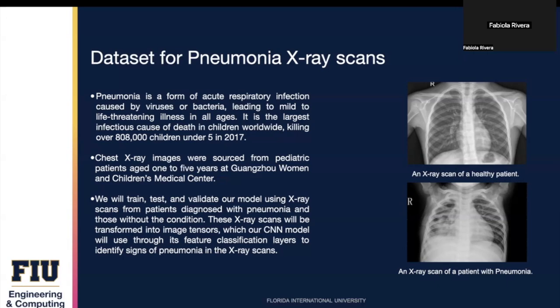An example of these can be found to the right of the screen. These images were part of routine clinical care and they underwent quality control to exclude low-quality or unreadable scans. The diagnoses were initially graded by 2 expert physicians, and then they were validated by a 3rd expert to ensure accuracy.